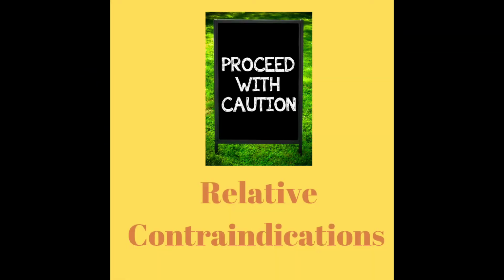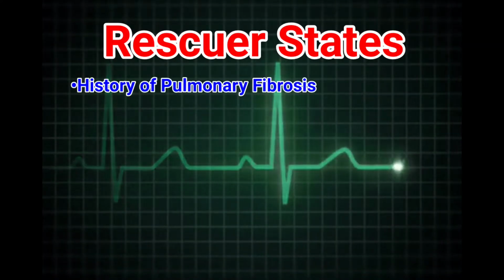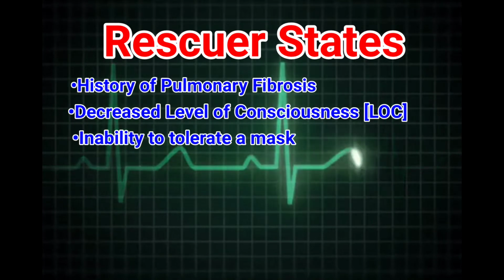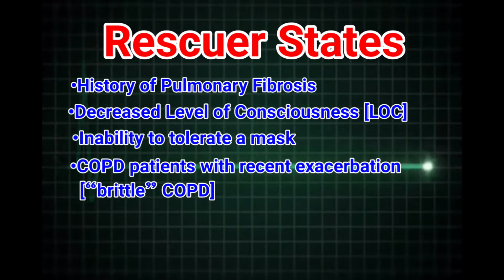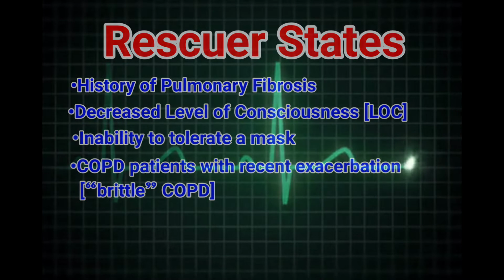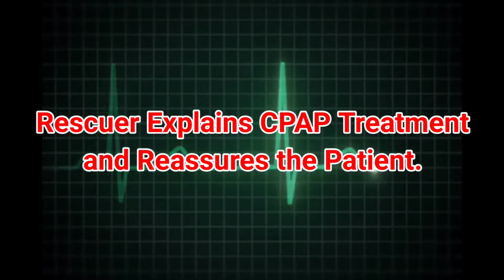Relative contraindications. Rescuer states, history of pulmonary fibrosis, decreased level of consciousness (LOC), inability to tolerate a mask, COPD patients with recent exacerbation, brittle COPD. Rescuer explains CPAP treatment and reassures the patient.